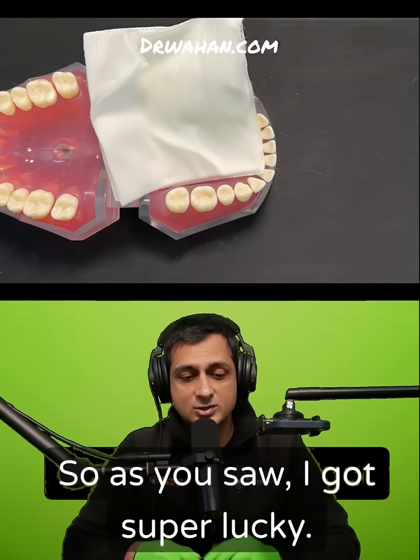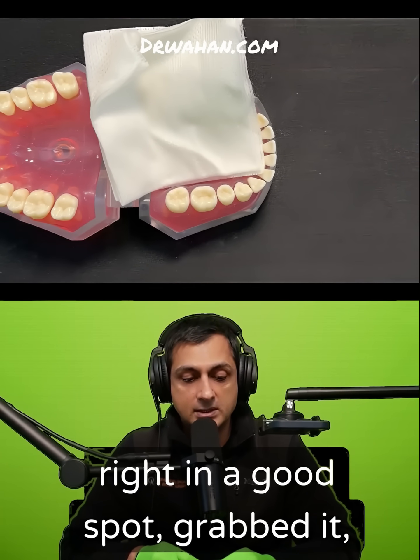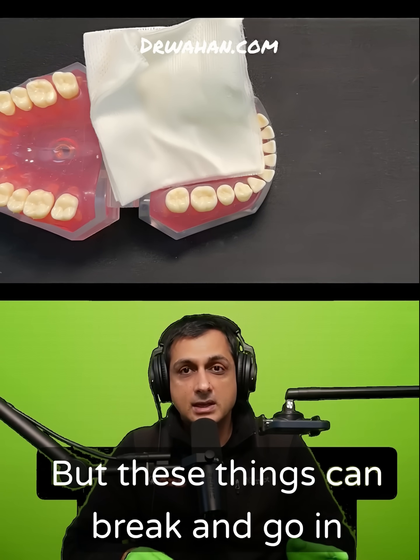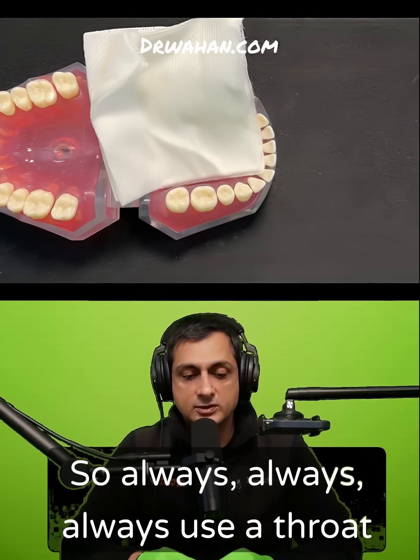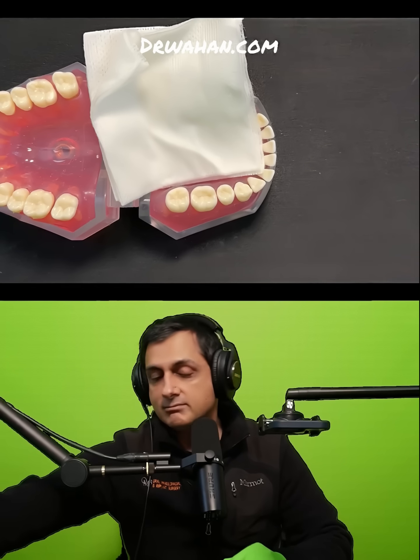As you saw, I got super lucky — the burr fractured off but it landed right in a good spot. I grabbed it, replaced it, and continued on. But these things can break and go in different locations, so always use a throat pack.